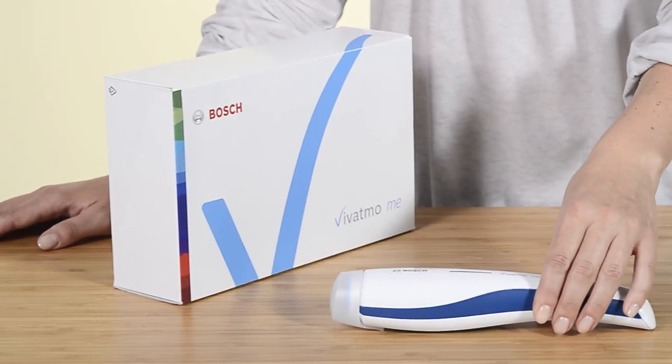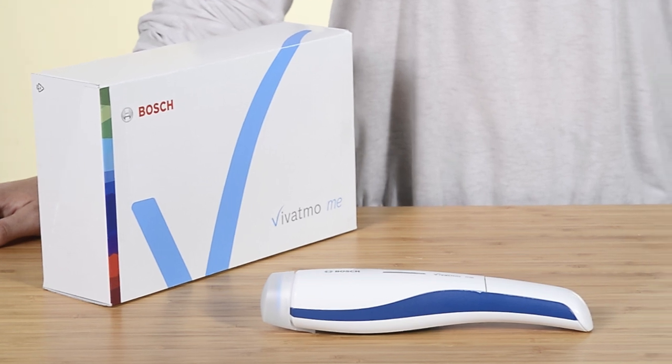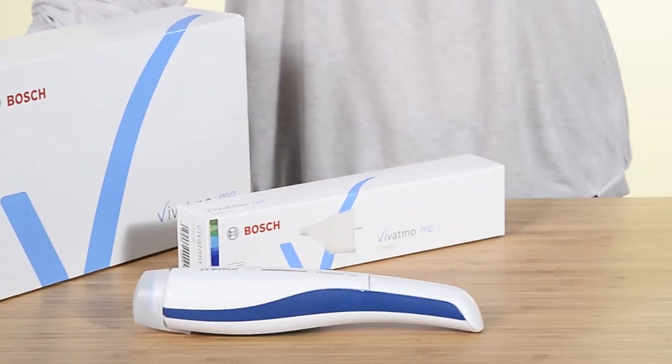All you need to get started are the items delivered in the set: the Vivatmo.me device, the securely packed Oxycaps, and four batteries.